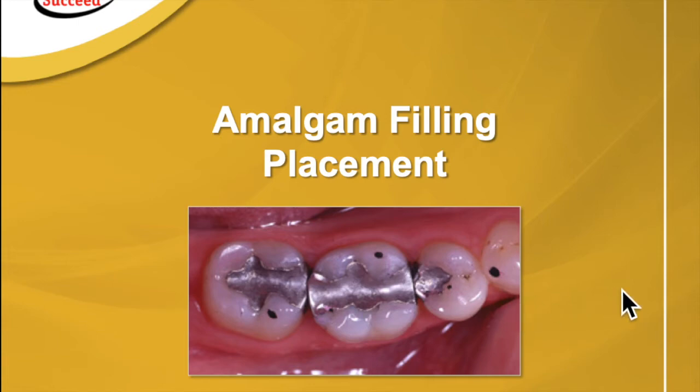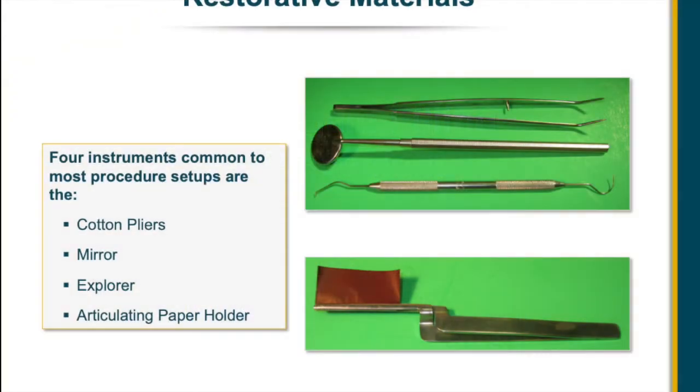Okay, so that's one of the most common restorations that has ever been in use: amalgam fillings, and they are still in use somewhat today. Mostly we see them primarily in pediatric patients, but occasionally you will find dentists still using amalgam fillings in adults.